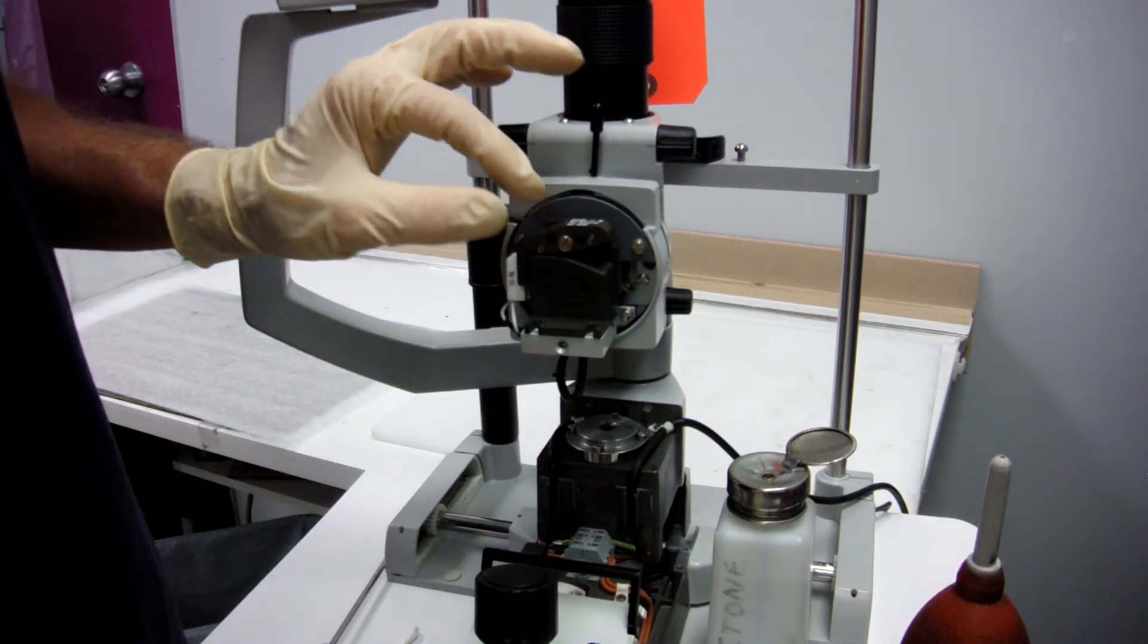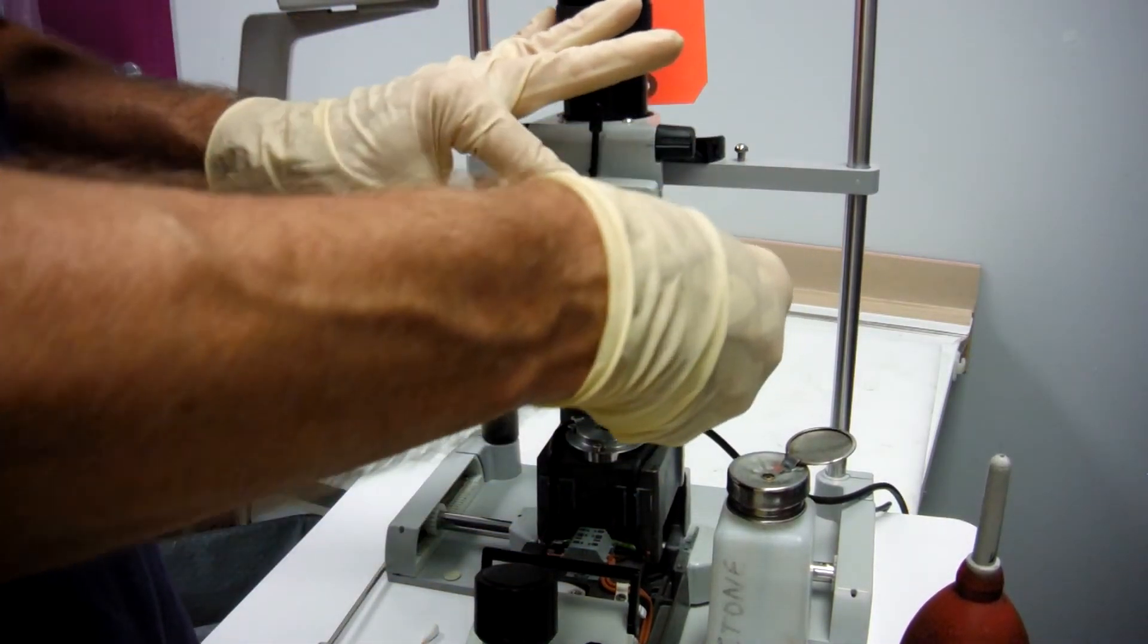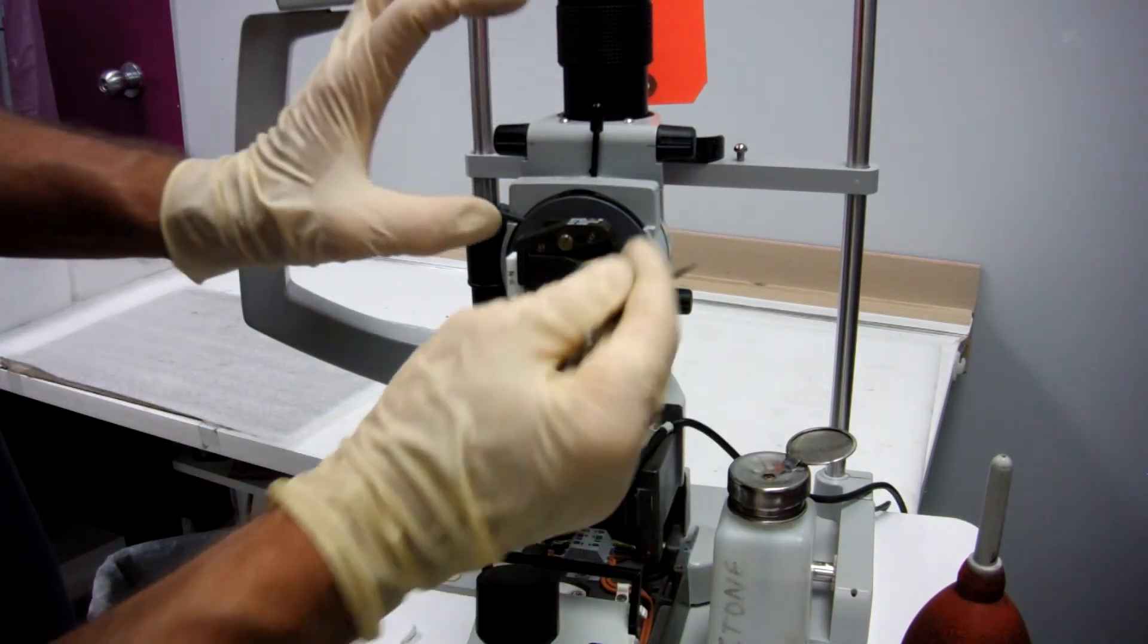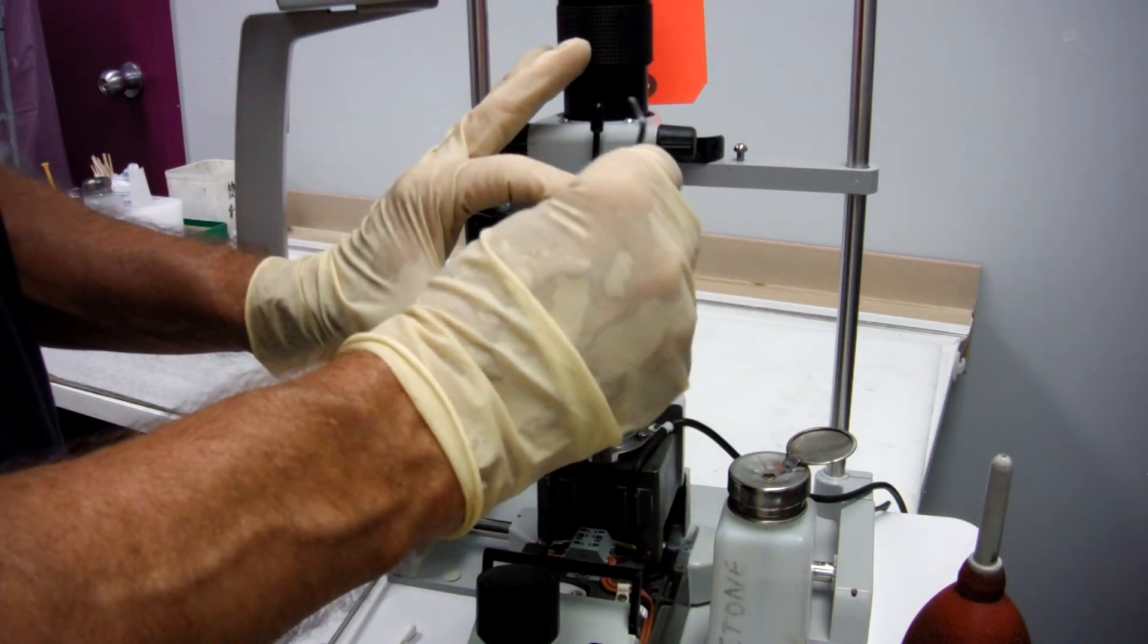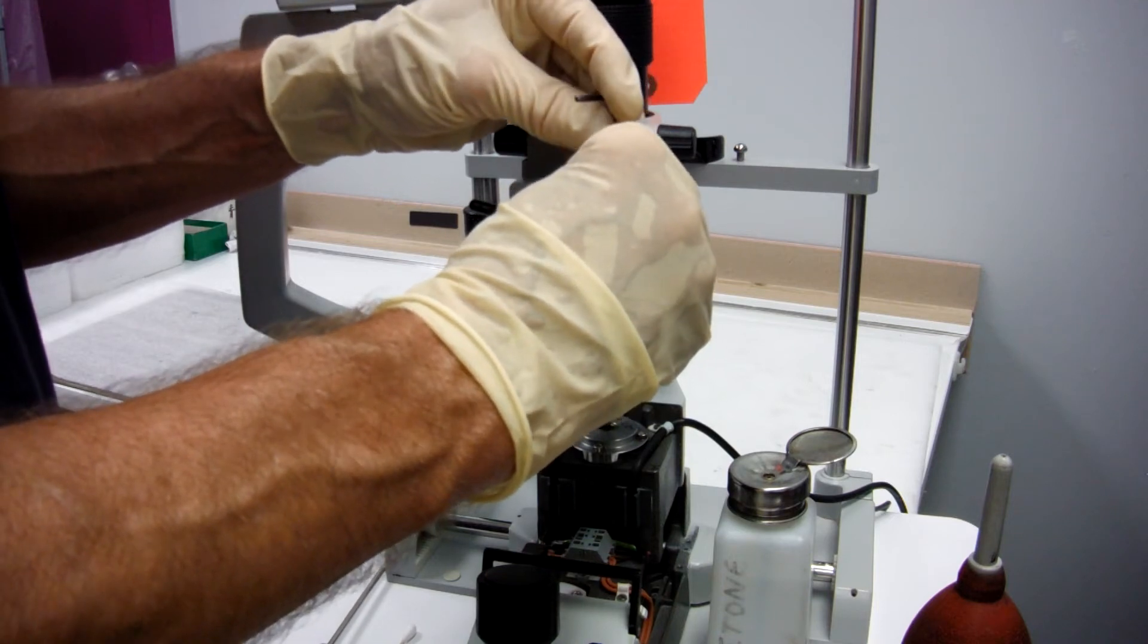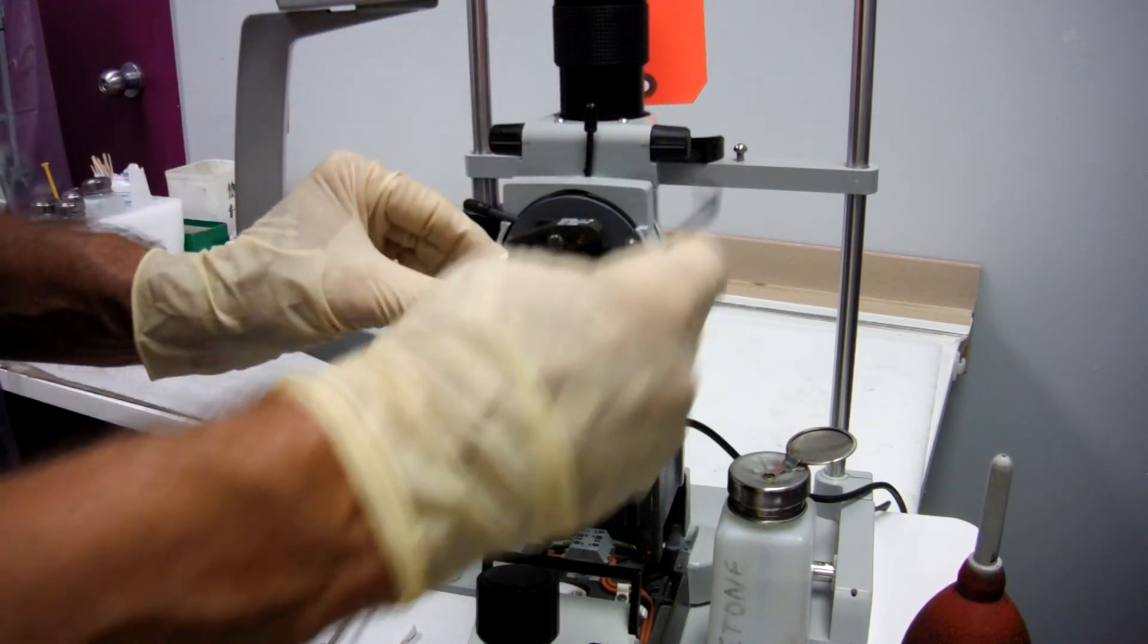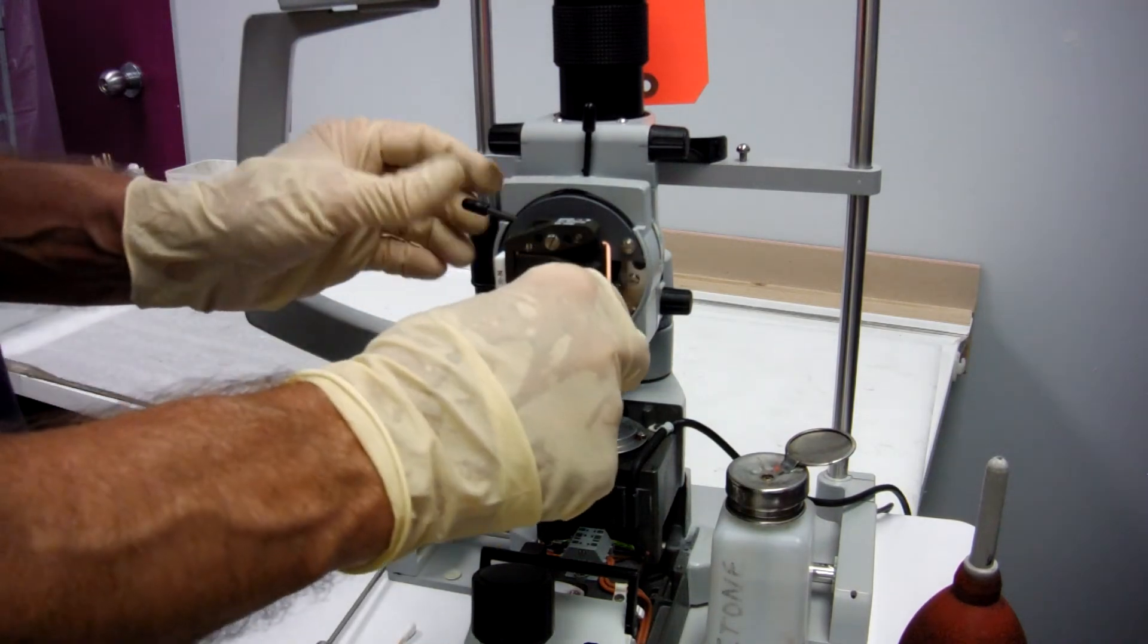What you can do is go ahead and put one screw in your light assembly because you're going to have to center your diaphragm assembly. Now that you've loosened it, now that you've removed it out of its original position, it might not be centered.